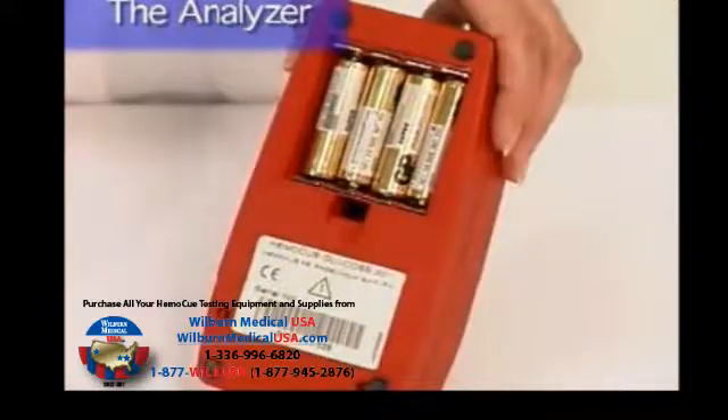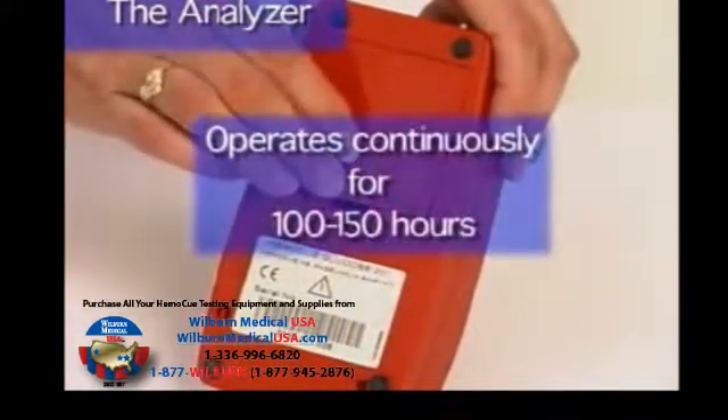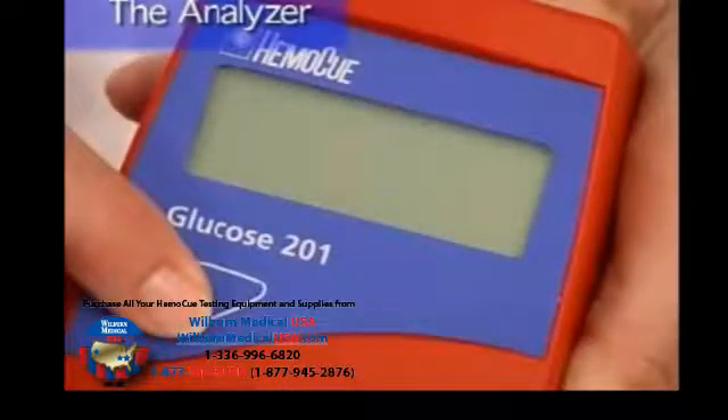The analyzer may also be powered using batteries. Place four AA batteries in the battery compartment. A new set of batteries can operate continuously for 100 to 150 hours. Remember, when going from battery power to main power supply, turn the analyzer off before connecting.